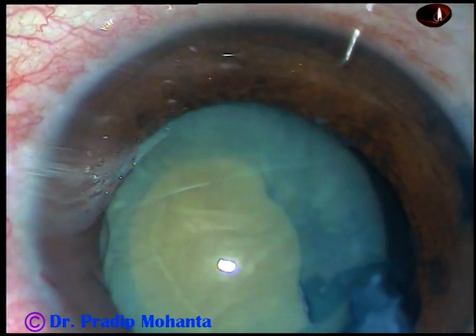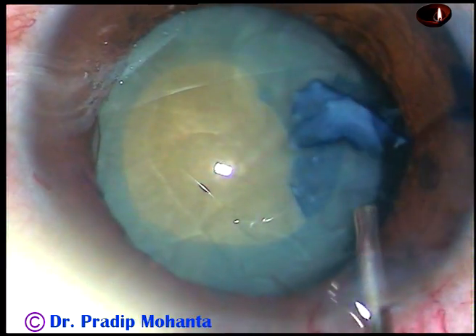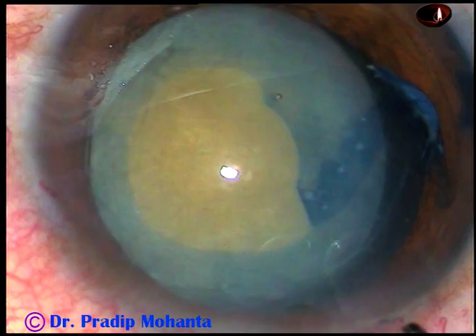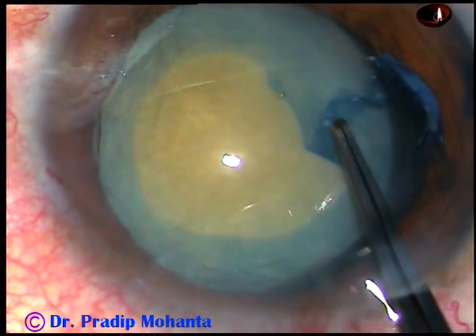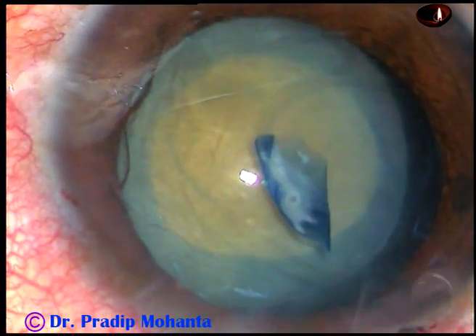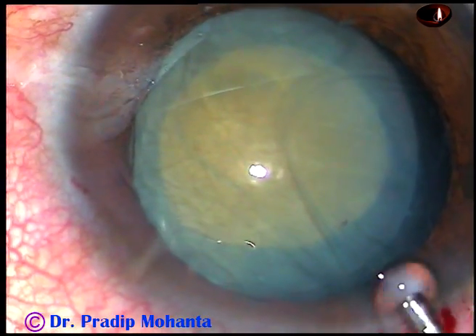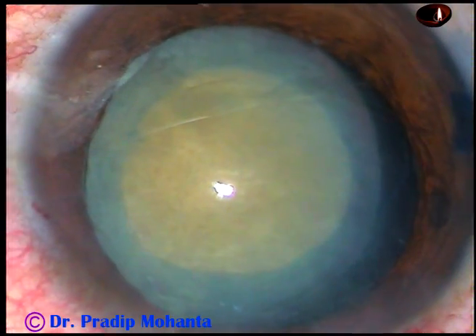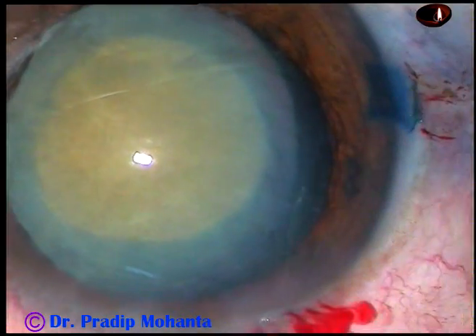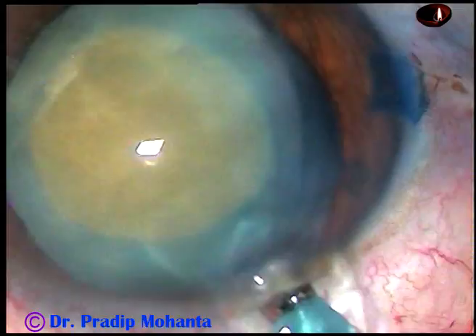The visibility has improved. Now I inject 2% HPMC again, take the utrata forceps again, hold the capsular tag, and do an adequate-sized rhexis. If there is a fibrous plaque at the central part, we should be able to do a rhexis around it. Now visco is injected and this is the time to introduce the phaco handpiece into the anterior chamber. This is the Oertli EC-TIF, and the machine being used is the Oertli Cataract 3. Now let us see how to manage a free-floating nucleus.